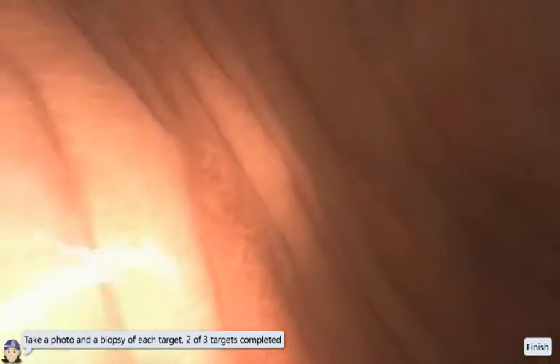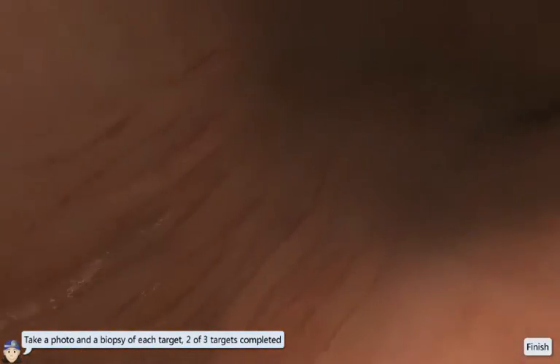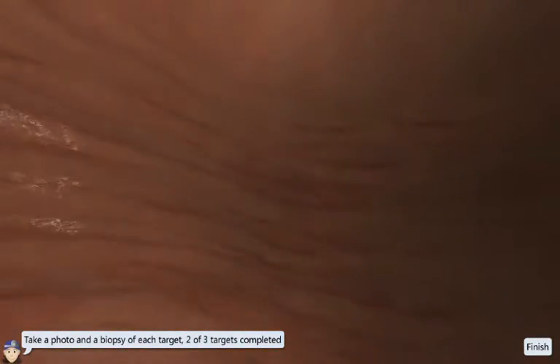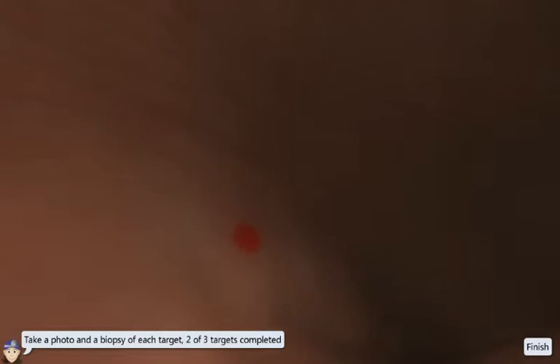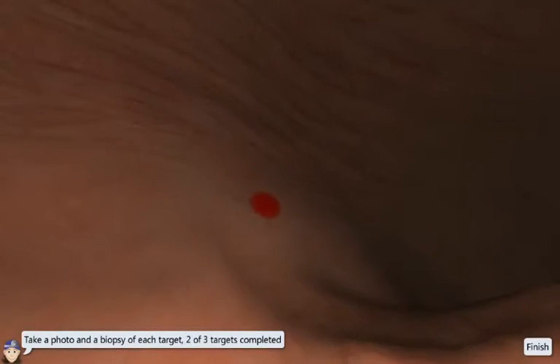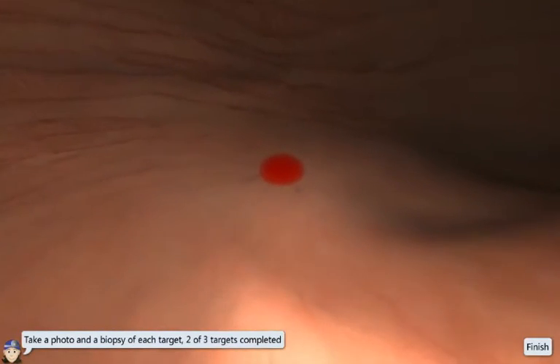When the papilla has been identified, there are three objectives left in this exercise: one, to examine the mucosal wall; two, to take a photo; and three, a biopsy sample of all red targets.